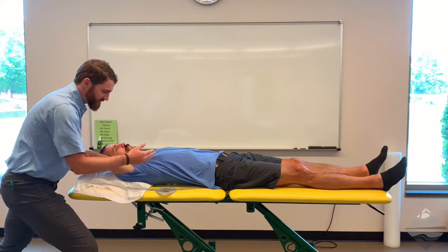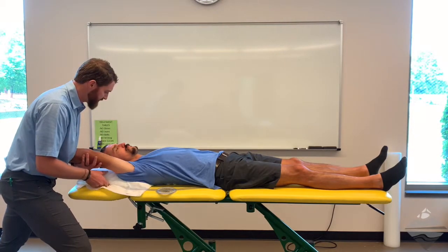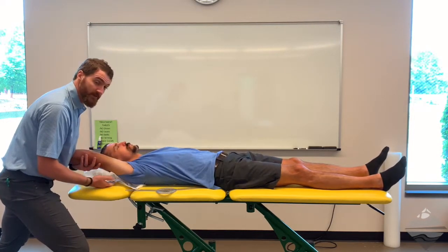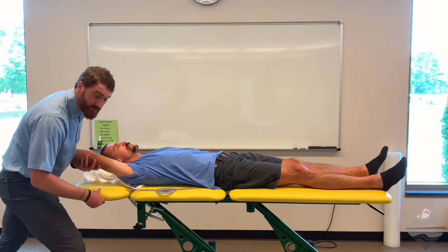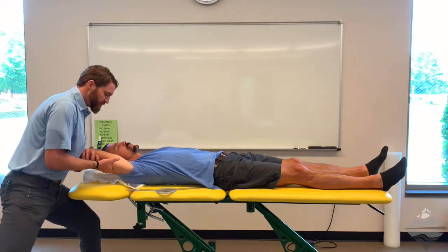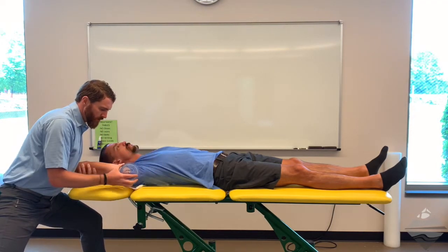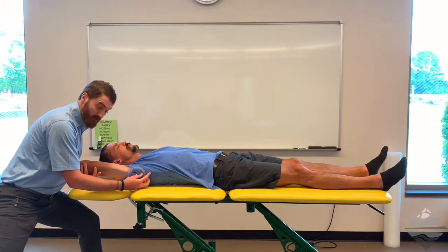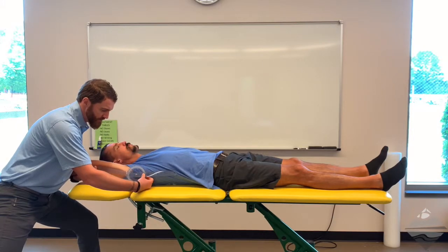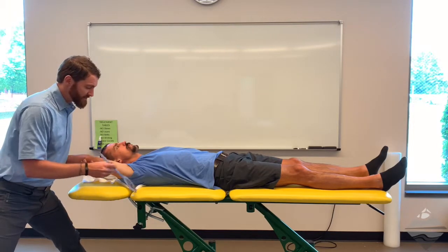When taking a flexion measurement, be mindful that the pillow can block end range of motion. You may ask the patient to lift their head and neck, slide the pillow over, and then relax. On a high-low table, if you have someone that's hypermobile, you can also move the headrest out of the way. We can grab our goniometer — the axis of rotation is the joint, the stationary arm is the trunk, and we're looking for the lateral epicondyle of the elbow. In this case we have 172 degrees of passive shoulder flexion.